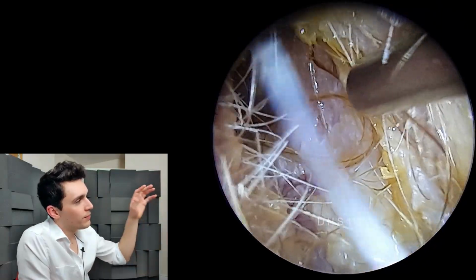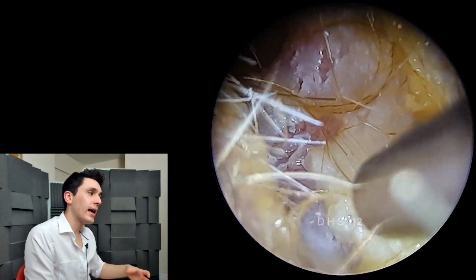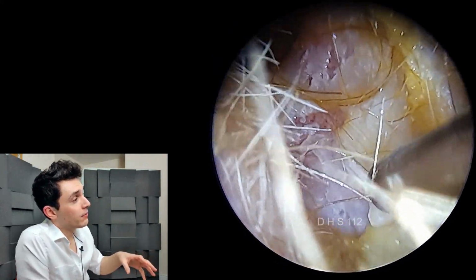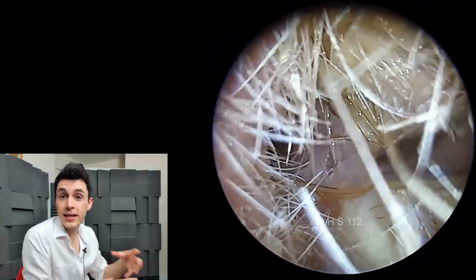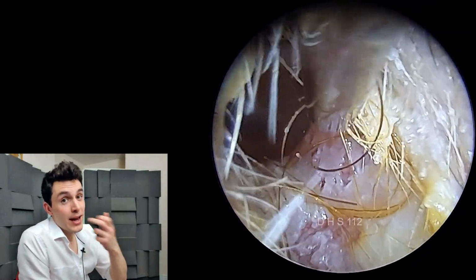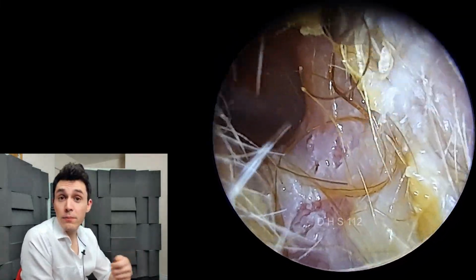So I'm trying to find opportunities to strip away what I can and get rid of as much dead skin as I can so that the infection doesn't reoccur. Because when you have dead skin, bacteria like to eat and live on and colonize on dead skin. That's what we call biofilm, which is basically like plaque on your teeth. That's just a mature colony of bacteria, and that's why it's so important to floss, right?